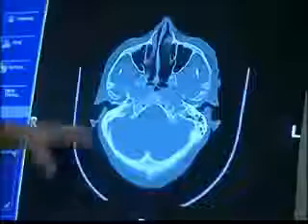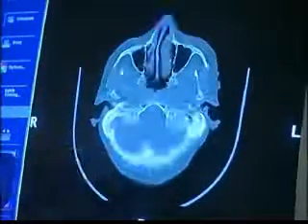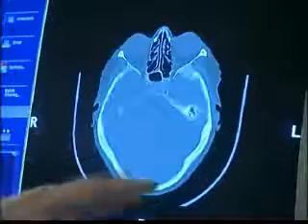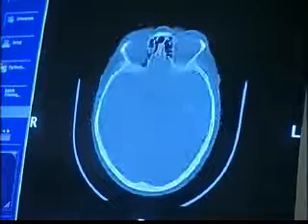Now we're at the top, and as this patient's got a suspected base of skull fracture, what we'd now do is go back and change it to bony windows. We've highlighted the bone as white and everything else is now dark, so it's not seen so clearly. So again, we're just looking through to see if there are any dark lines in the skull which could represent fractures.